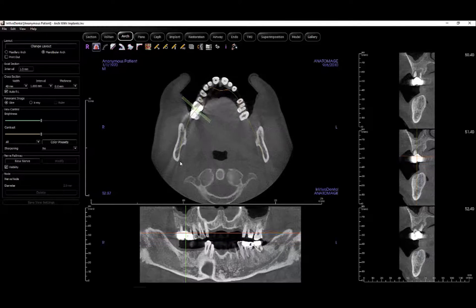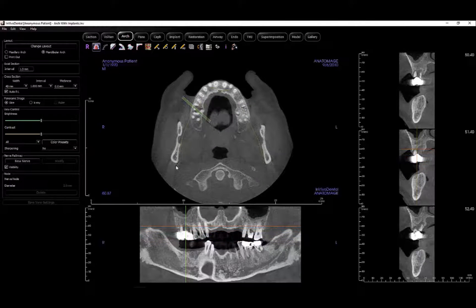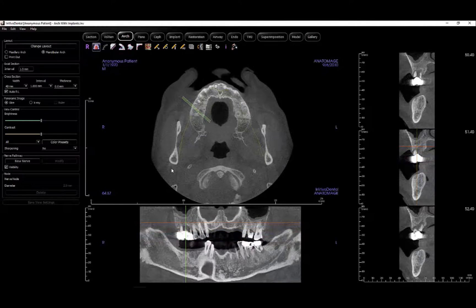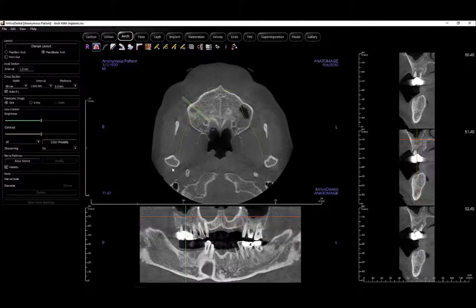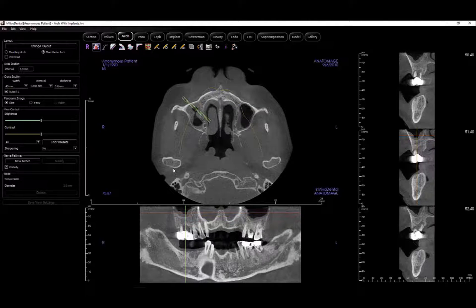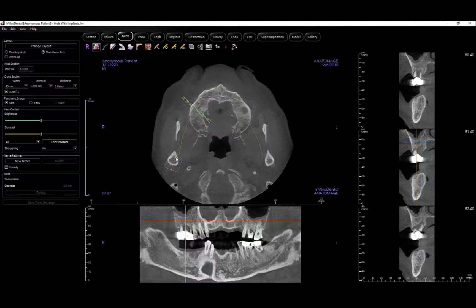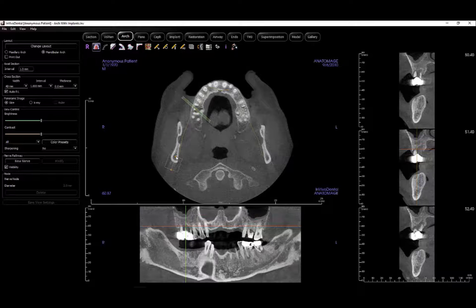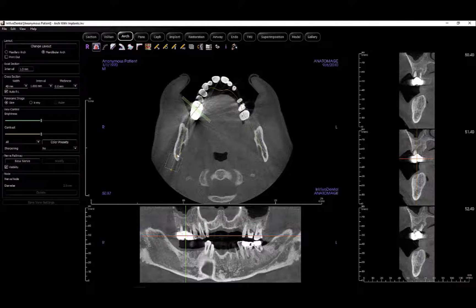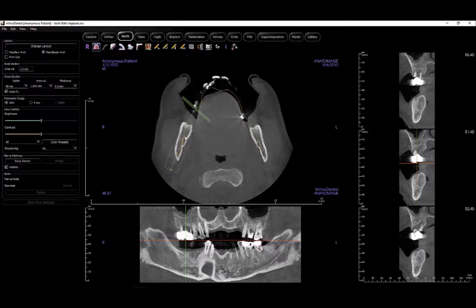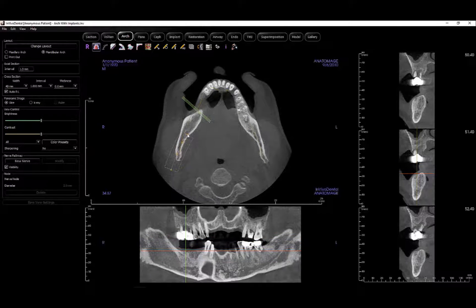To create a mandibular arch, start by scrolling up through the axial cross sections until you can see the condyle. Place the first point behind the condyle and place the other points along the mandible. If the nerve canal is visible, you can use it as a reference to place your points.